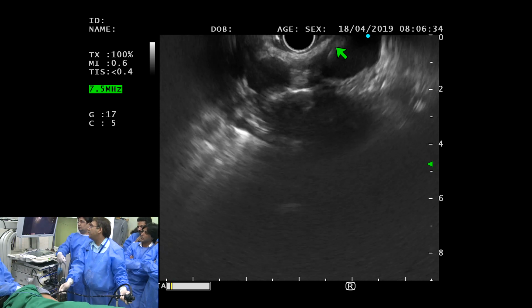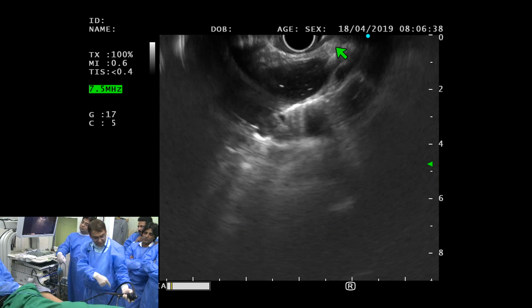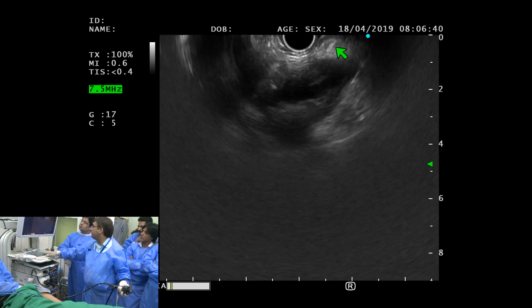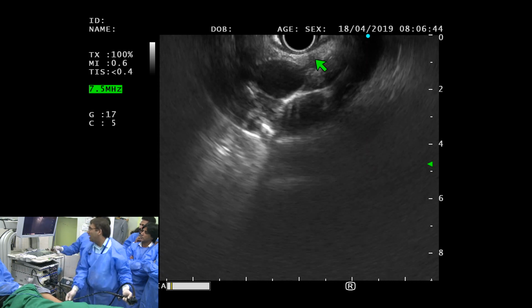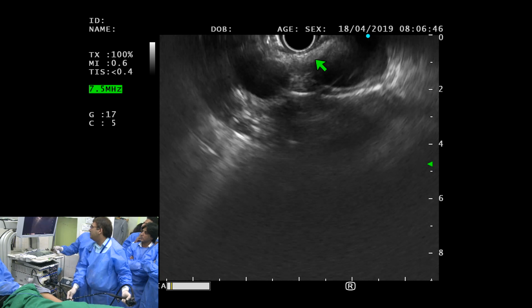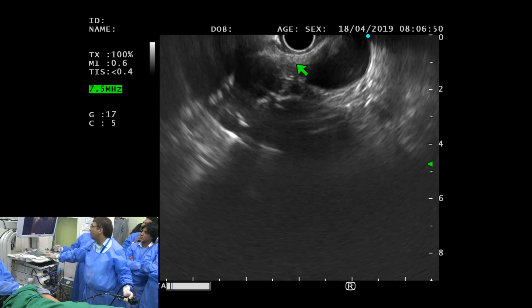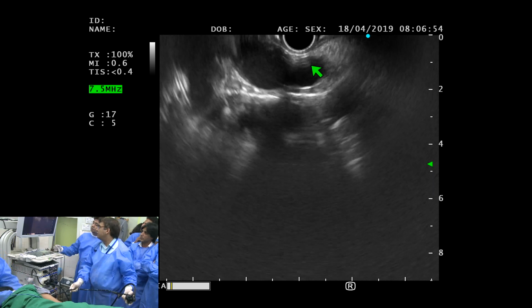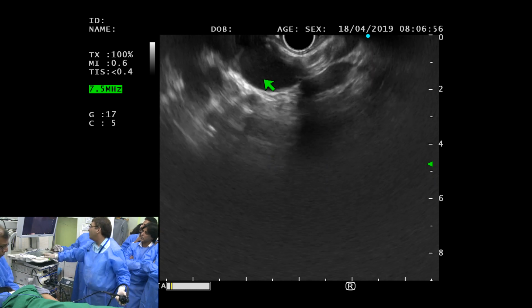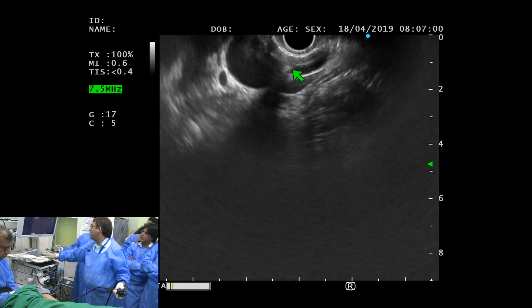When you do that, sometimes they cough because you rub their trachea. With the views facing the patient, you can see what we call an AP window, even though it's not, it's more like a little bit above the AP window. That's the area we are interested in. Next, I bring the scope out. You can see the left carotid coming off the aortic arch right here.